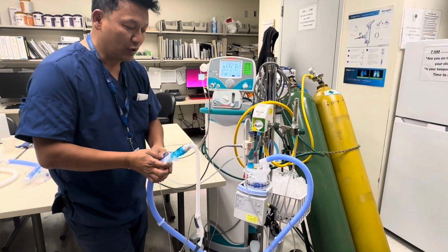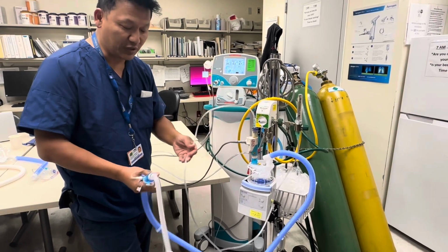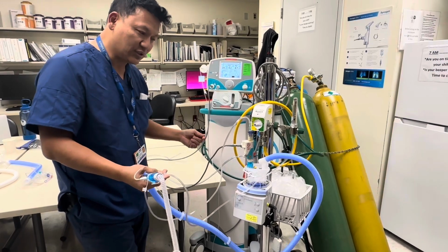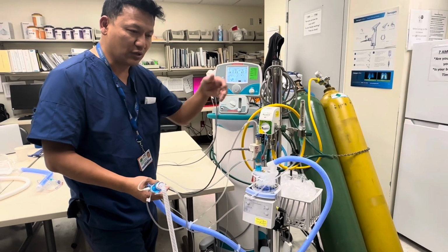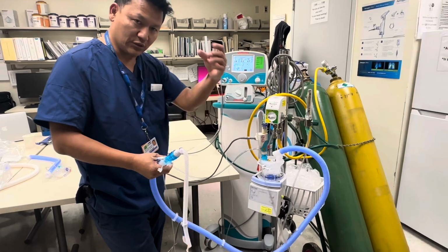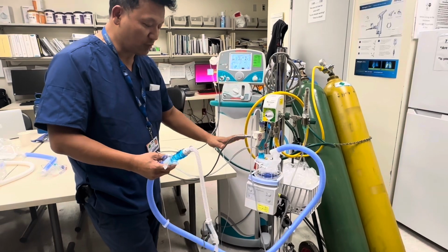With the HiFlow, the flow from here goes to the module. We couldn't do it because we didn't know where to connect this. If you connect it to the oxygen cylinder, then it would give extra oxygen, and that oxygen couldn't be connected to the airflow, the port connector for the oxygen. So we couldn't do it. So this is what we came up with.